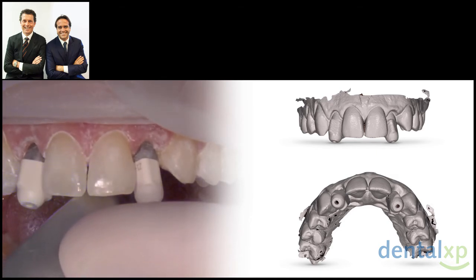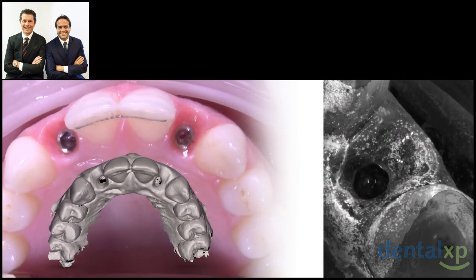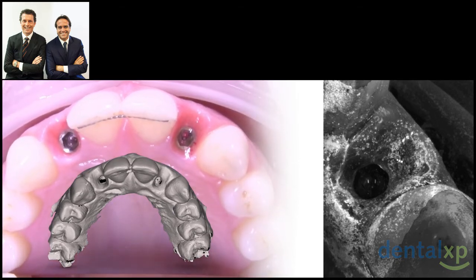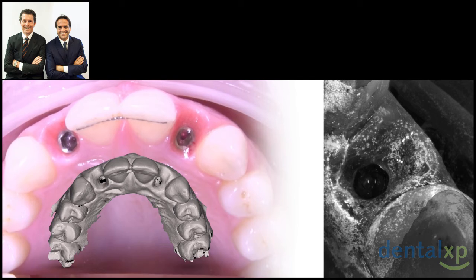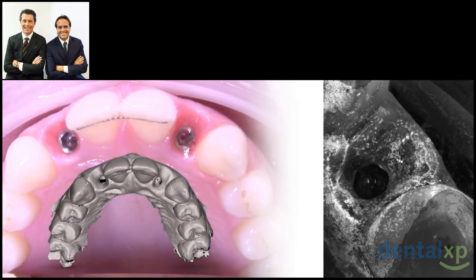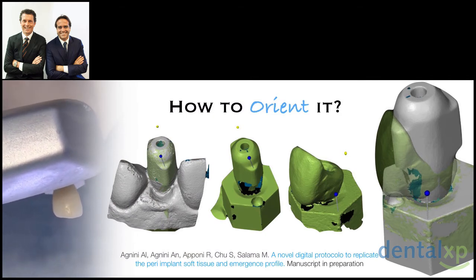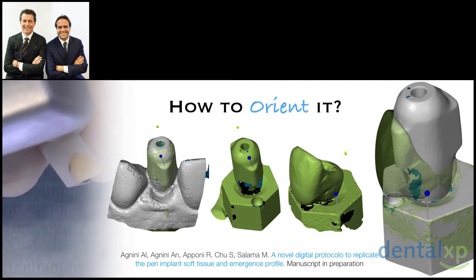Yes, and from the occlusal view, you can appreciate the root profile and the soft tissue thickness, which are exactly duplicated in an STL file. But we also know that we spend a lot of time trying to maintain that buccopalatal volume, and as soon as we unscrew the provisional restoration, the gingival tissue tends to collapse. But digital technology also gives the opportunity to overcome these slight problems by simply taking the digital impression of the provisional restoration emergence profile, because acrylic or PMMA does not shrink, if you compare it with the gingival tissue.